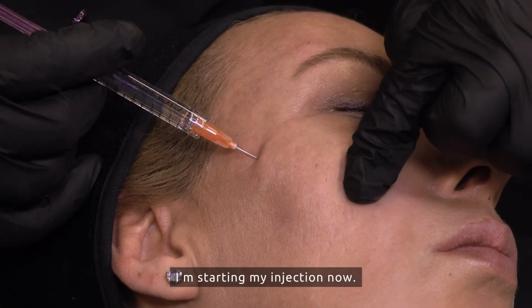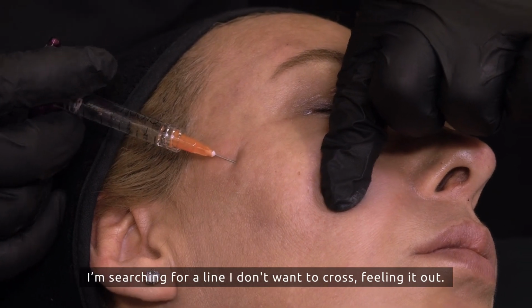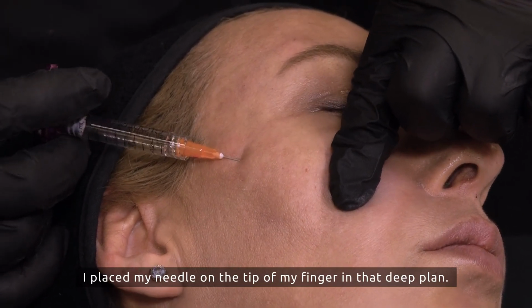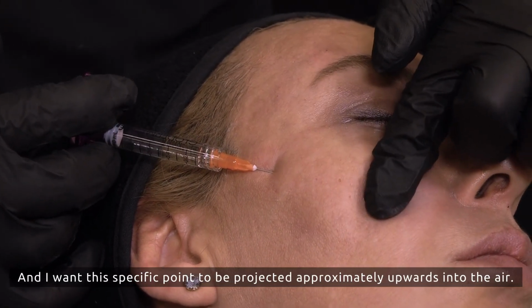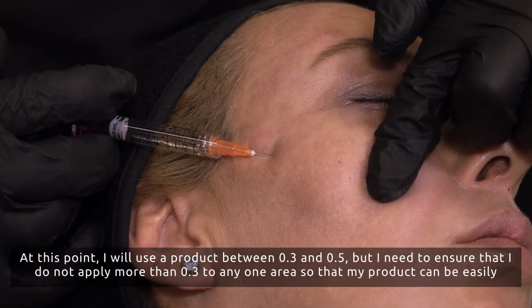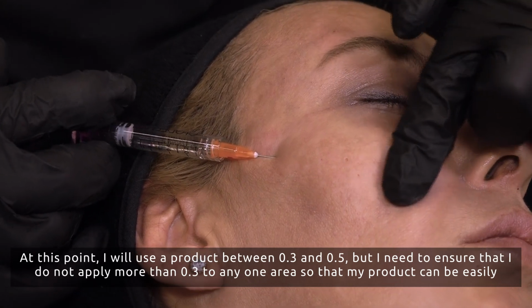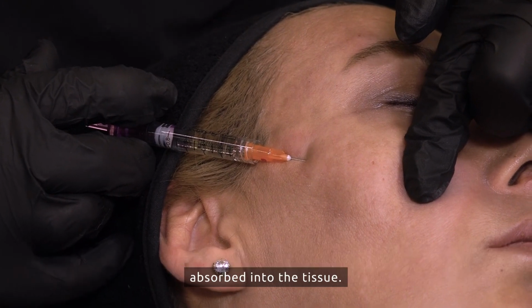I'm starting my injection now. I'm searching for a line I don't want to cross, feeling it out. I place my needle on the tip of my finger in that deep plane, and I want this specific point to be projected approximately upwards into the air. At this point, I will use a product between 0.3 and 0.5, but I need to ensure that I do not apply more than 0.3 to any one area so that my product can be easily absorbed into the tissue.